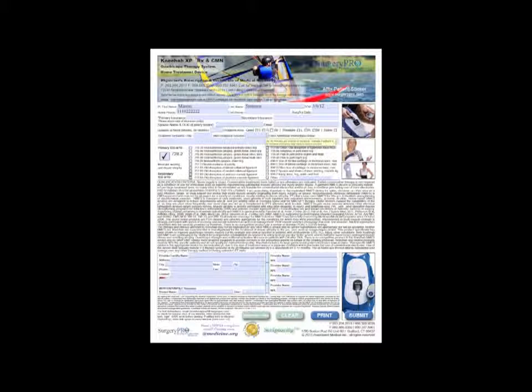Okay, so I've tabbed over to say maybe I'm going to do the right quad, and I'm just using the spacebar now to select that right quad. Tab forward, and you know what? It wasn't the right. I'm using Shift Tab, and now I can select the left quad and deselect the right quad with the spacebar. So again, tab to move down, Shift Tab to move up, spacebar to select a checkbox, and then of course I can type.